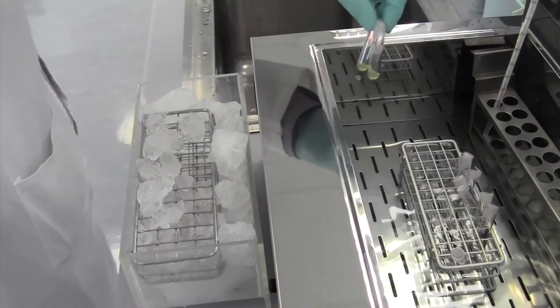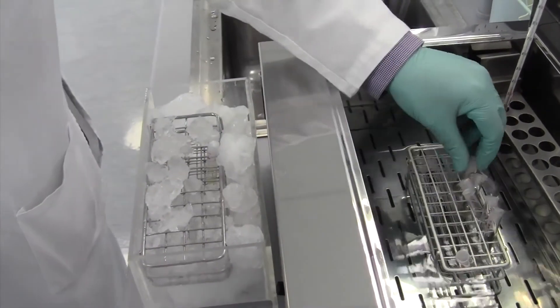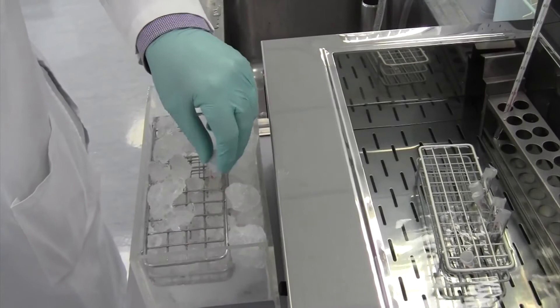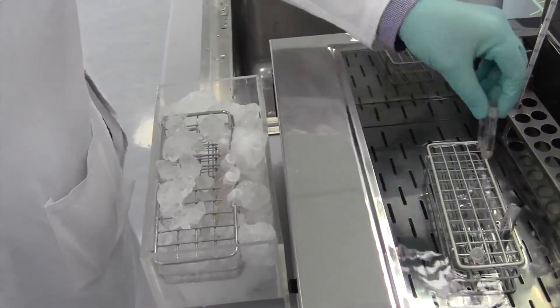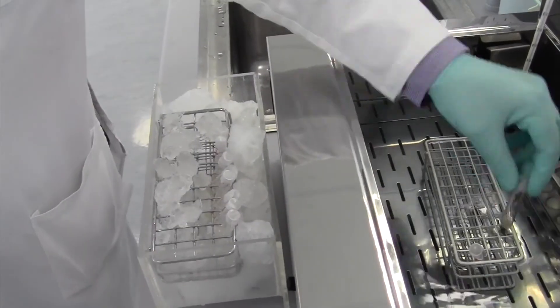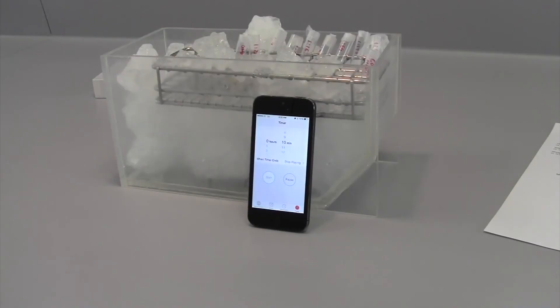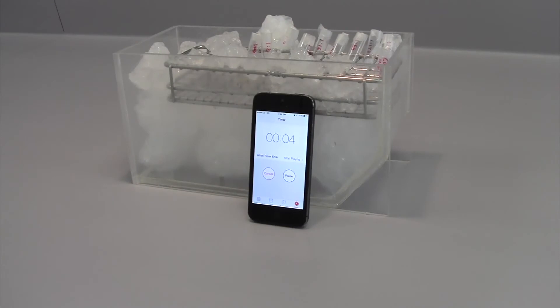After two hours, remove them from the water bath and transfer the samples instantly into the ice bath. Remember to keep the samples on ice until tested. But please be aware that the minimum duration of the ice bath is 10 minutes.